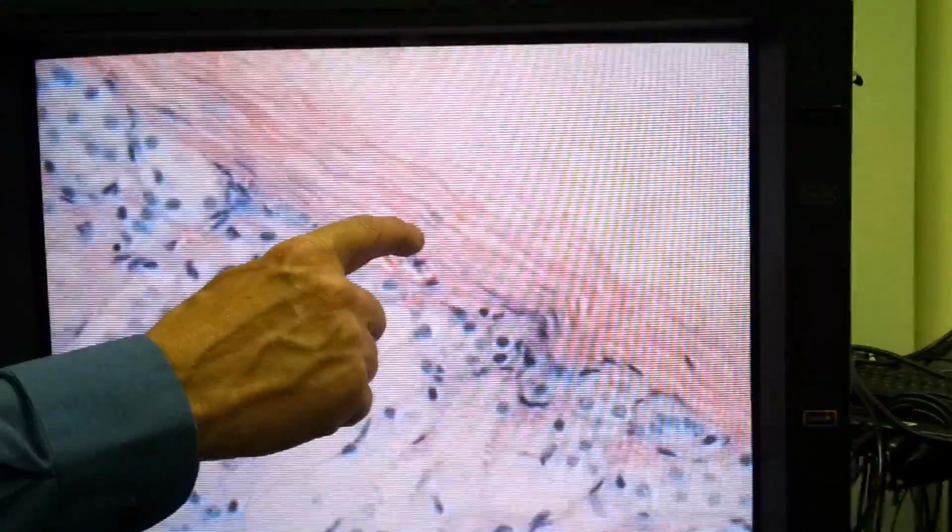Now here you have the capsule. I could point to this kind of cell, and you'd say that's a fibroblast. It's not an endocrine cell, but this is the very typical presentation of connective tissue. That's eosin staining the collagen pink, and right under the surface you start getting all these capillaries.